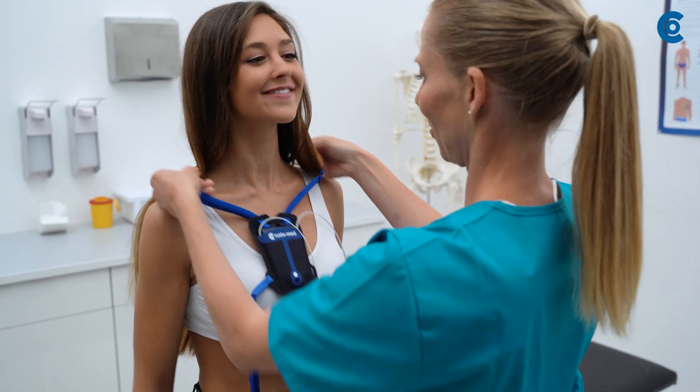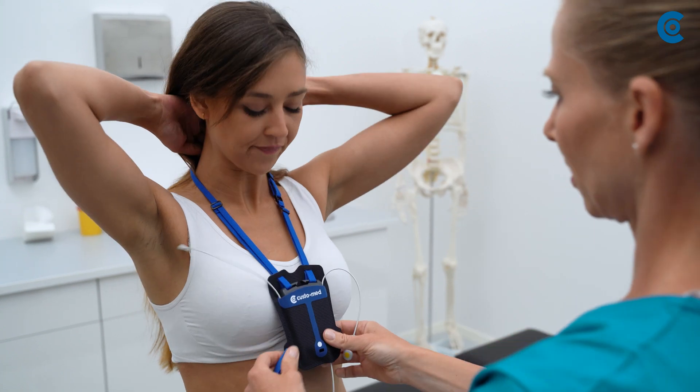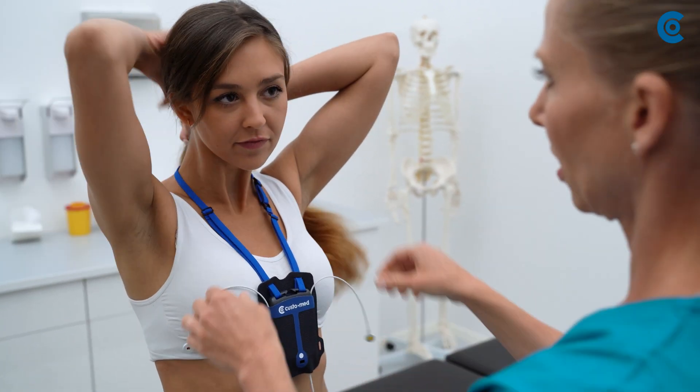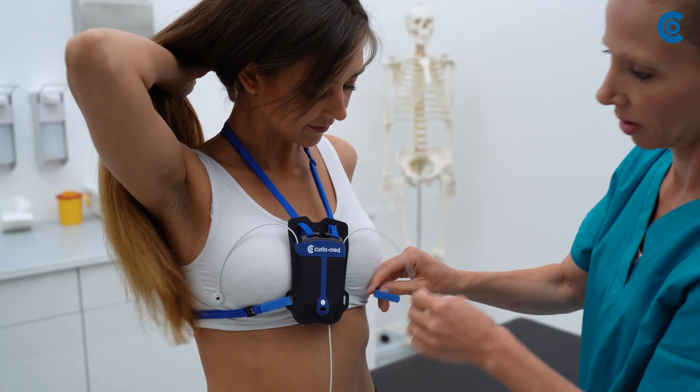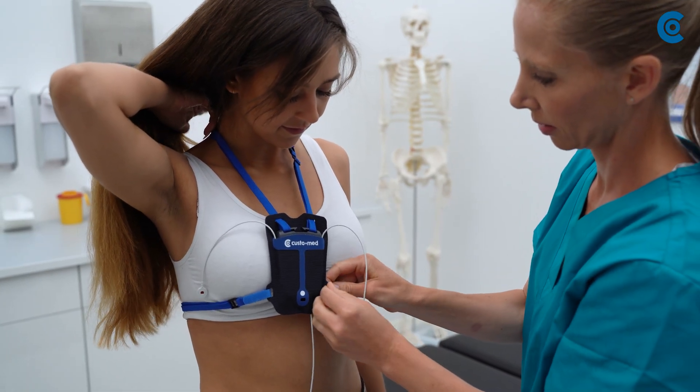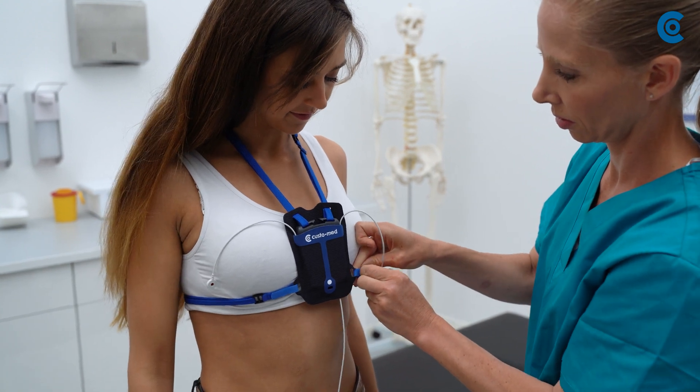Now hang the recorder around the patient's neck and adjust the neck strap so that the recorder is in the middle of the chest. Pull the chest belt tight so that the recorder has a stable hold on the patient.